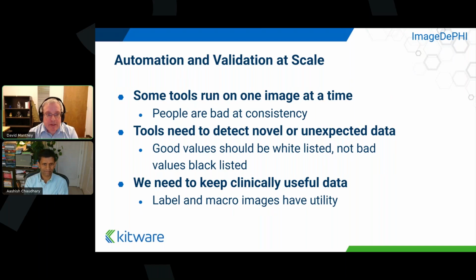If you break down the date, you might write it month, day, year, or they might write it year, month, day. It might be context dependent. If you look at how you've named all the files in your documents folder, I bet you weren't particularly consistent at them. Most people aren't. And so we want this to be consistent. We want to be certain that every time we de-identify images, we've done it correctly and thoroughly.